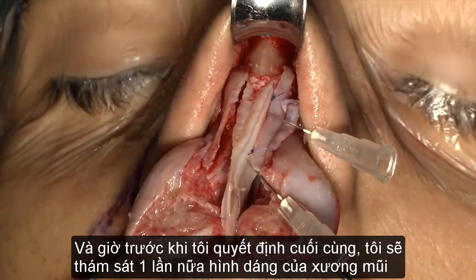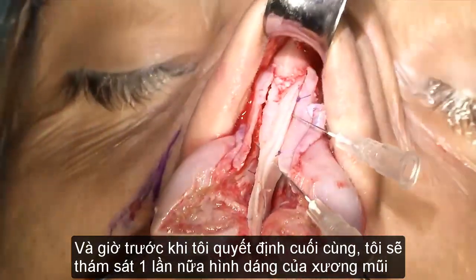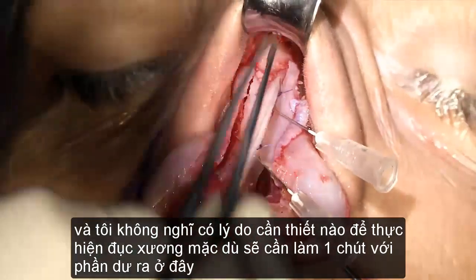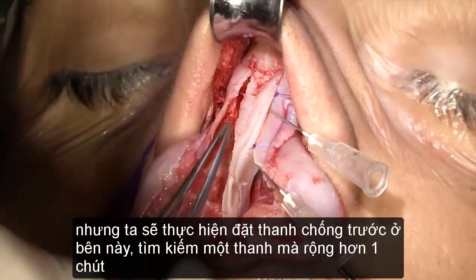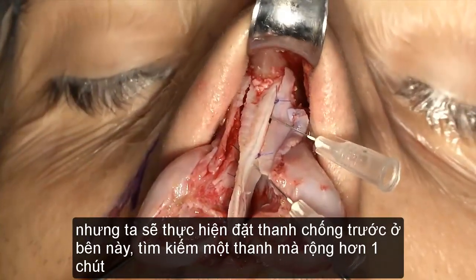Now, before I take this final decision, let me just inspect once more the shape of the nasal bones, just in case. No, I don't think there is a reason to do an osteotomy, although there will be a reason now to play with this axis here. But we'll do it first. Let's put another spreader on this side. Let me look for a piece which is a little bit wider.